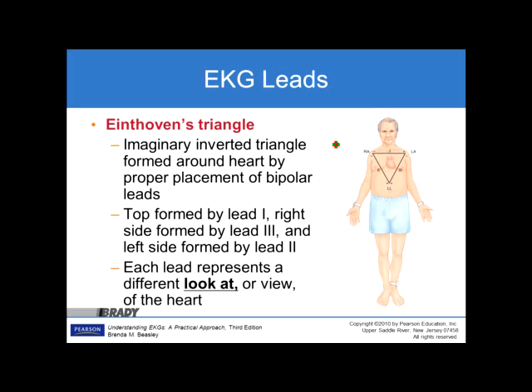Each lead represents a different look or view at the heart, and that's always going to be from the perspective of the positive electrode. So this here is lead 1, this here is lead 2, and this here is lead 3. Positive electrode, positive electrode, positive electrode.